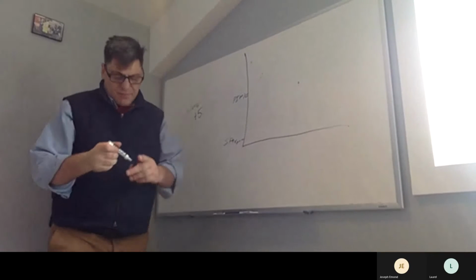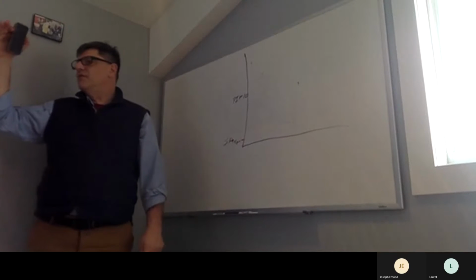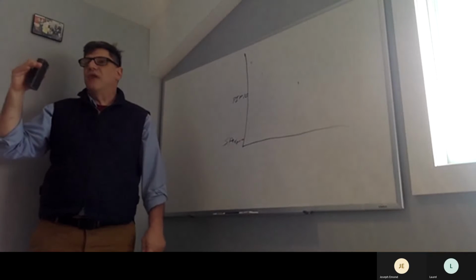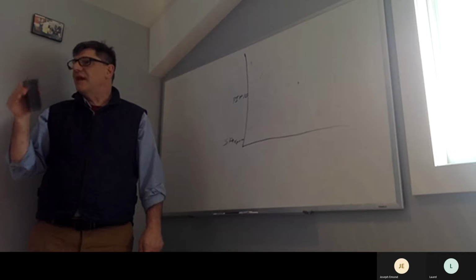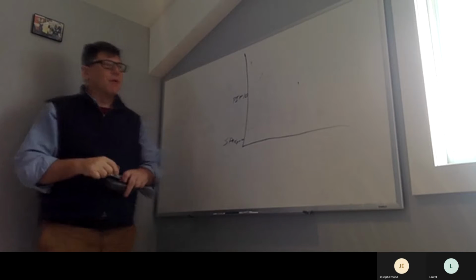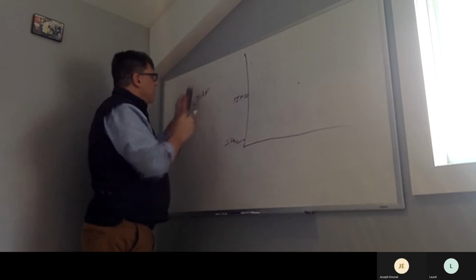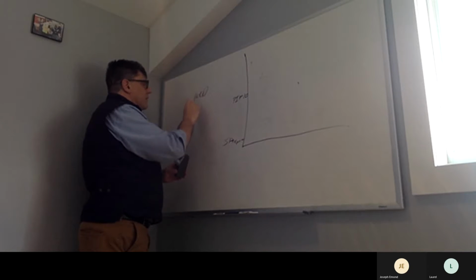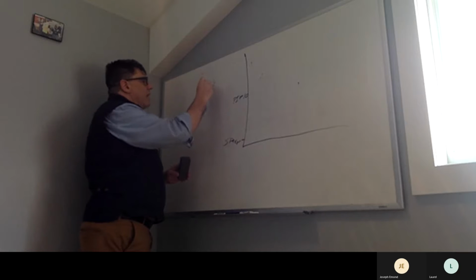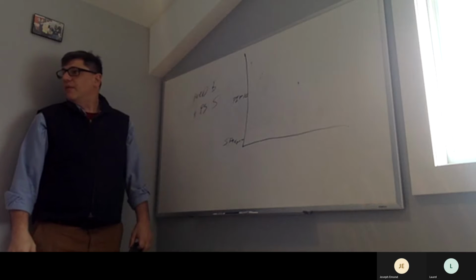This machine will also, and you should, please start up in mask CPAP. Don't go to adult, scroll down to mask CPAP. If you do that, your leak compensation is turned on and your alarms are much more appropriate for a mask, not intubated. So please start up in mask CPAP mode. Then I have CPAP, let us say PEEP, plus pressure support. So if my PEEP is at 5 and I add 5 more, it's 10. Everybody on board with that?